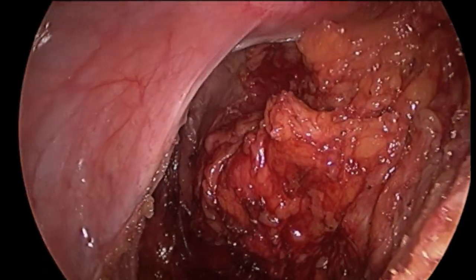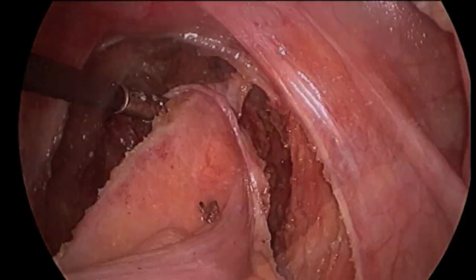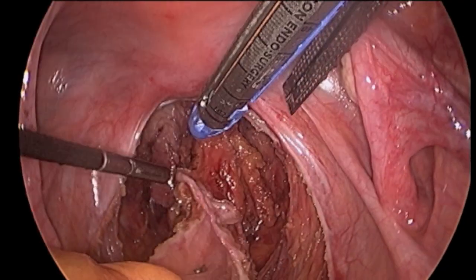After sufficient mobilization is achieved, the surgeon performs a digital rectal exam to precisely identify the location of the rectal tumor. Next, a laparoscopic stapling device is used to carefully divide the rectum below the tumor.